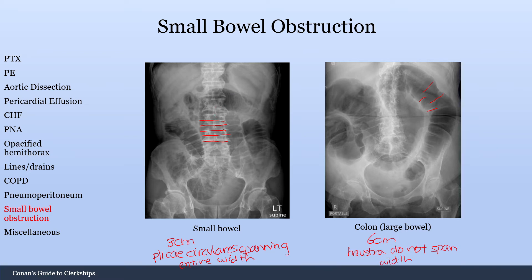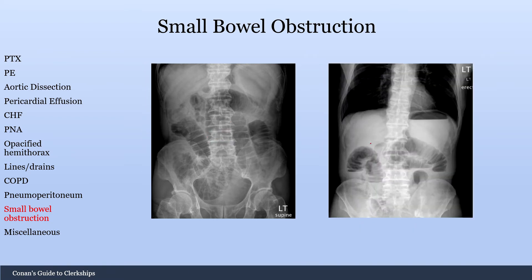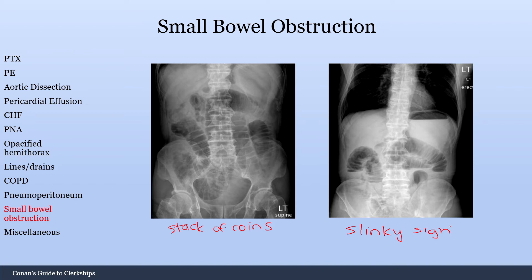Pretty easy to identify small bowel from large bowel — just check if the lines indenting are going the full width, which would be small bowel, or only part of the way, which would be large bowel. Here's an example of small bowel obstruction. Don't confuse the stomach bubble with free air under the diaphragm — this is just the stomach bubble. For small bowel obstruction you're going to see the stack of coins sign, and notice you don't see any colon — ascending, transverse, or descending. You only see small bowel. This is also called the slinky sign or step-ladder appearance. These are both signs of small bowel obstruction.